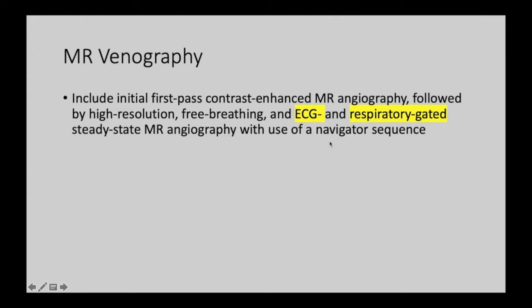MRV is not routinely performed in our center, but just for knowledge, MRV can be used to evaluate the superior vena cava as well. It includes an initial first pass contrast enhanced MR angiography followed by a high resolution free breathing, ECG and respiratory gated steady-state MR angiography with use of a navigator sequence. Our MR does not have an ECG gated sequence available, just for information.